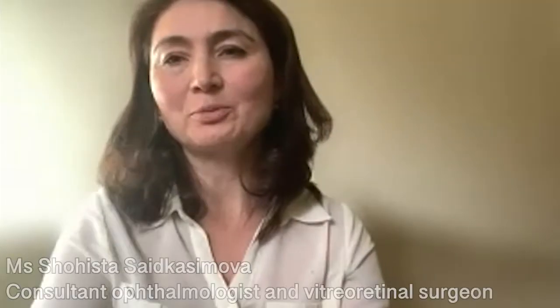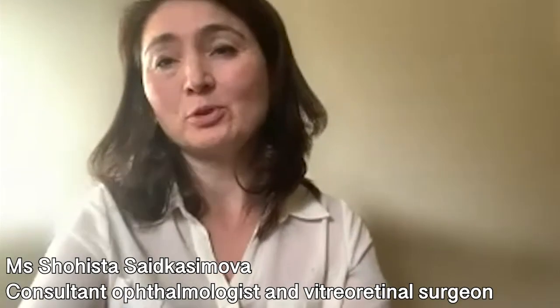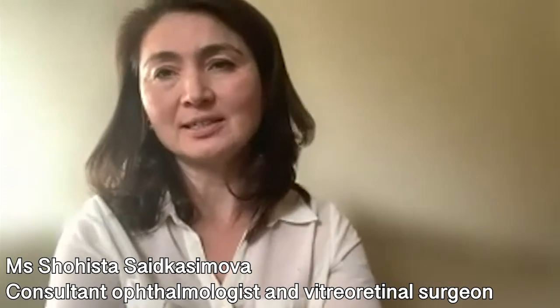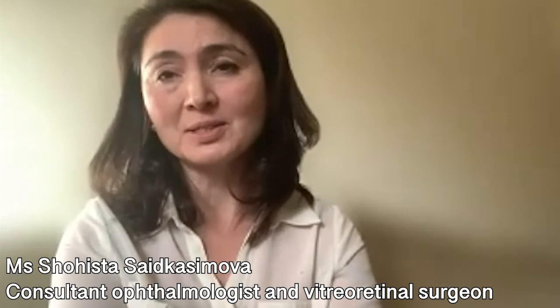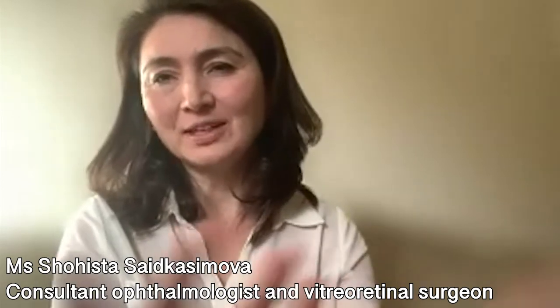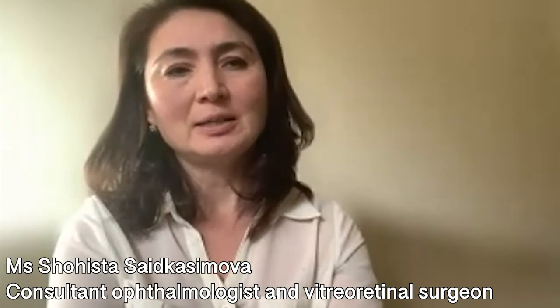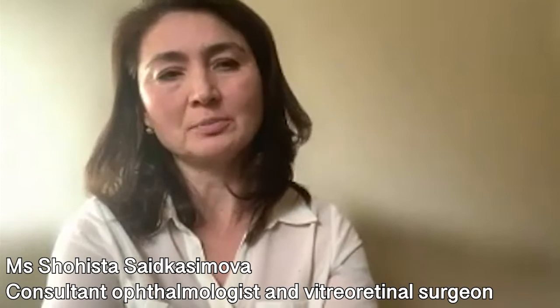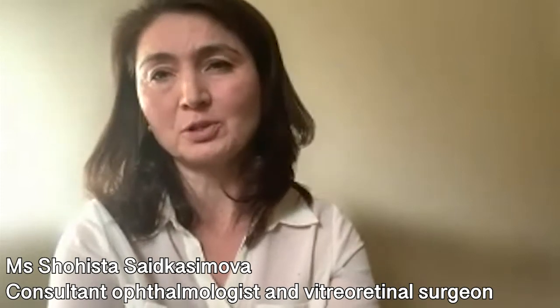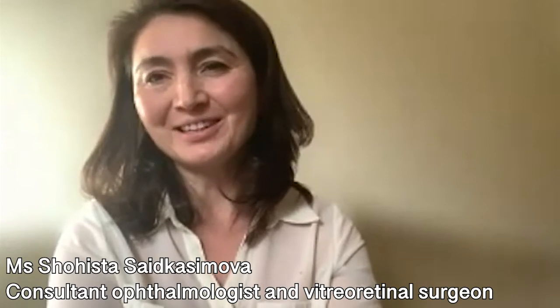Well, cataract is one of the most commonly performed surgeries, and it's performed under topical anesthetic as a day case. On average, it takes between 10 and 15 minutes, unless it's a complex case, in which case it might take a little bit longer. The surgery is performed using ultrasound. The technique is called phacoemulsification. That's the most commonly used technique. There are others, but they're less used now.